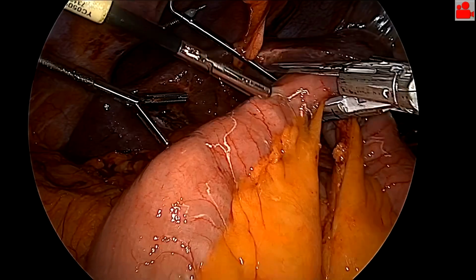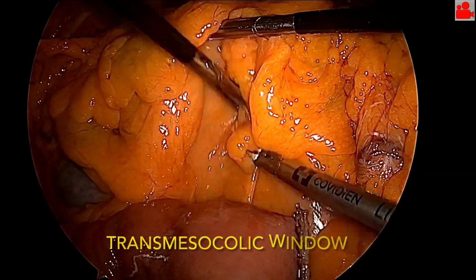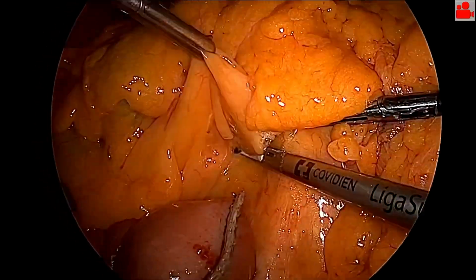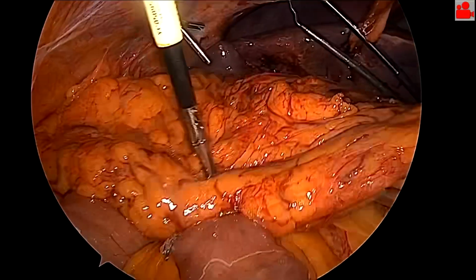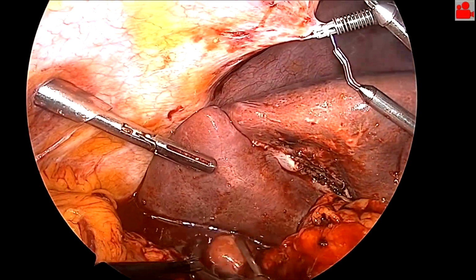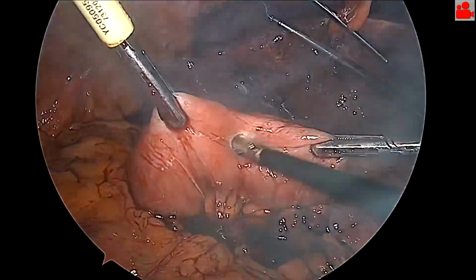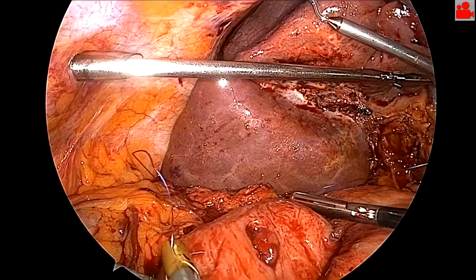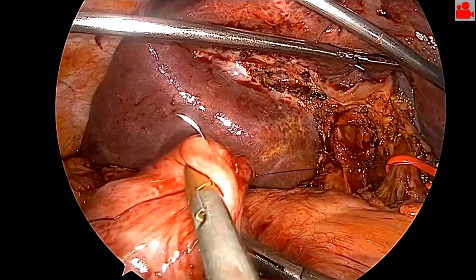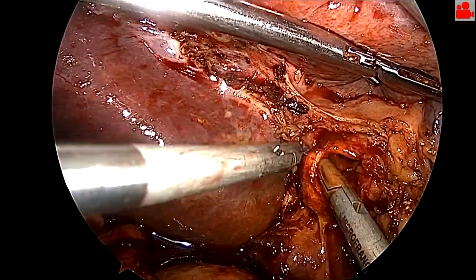Finally, we proceed to the reconstruction stage. A Roux limb was transected at a distance of 50 centimeters from the Treitz ligament and was passed in a transmesocolic manner. In a laparoscopic approach, this stage is also considered challenging from an ergonomic point of view, and it's important to mention that it was performed by a highly qualified team with experience of performing laparoscopic Whipple procedures.